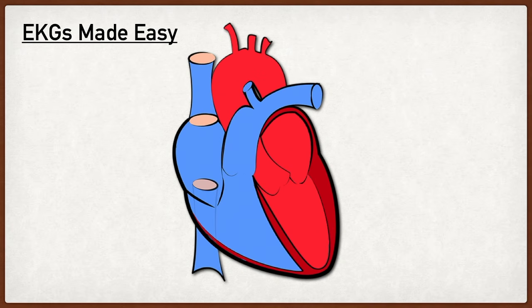In order to make EKGs easy, we're going to walk through one cardiac cycle, and as we do that, we're going to draw out the EKG line, and it's all going to come together. So there are two main phases to the heart. There's diastole when the heart's at rest and it's filling with blood, and then there's systole when the heart's squeezing and pumping blood forward. Let's start with diastole.